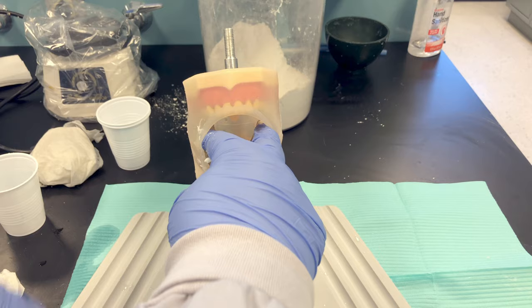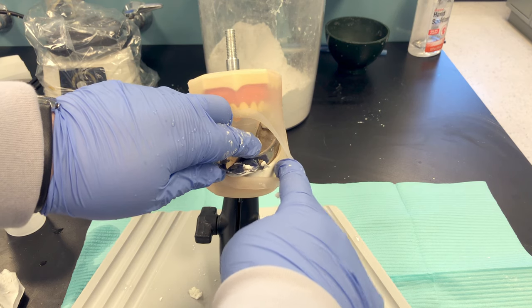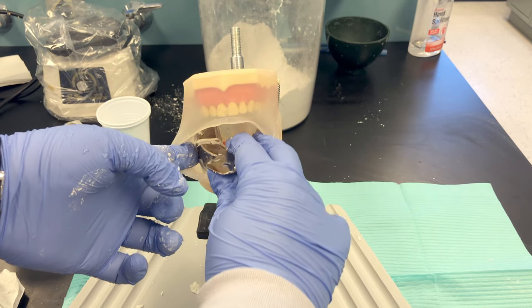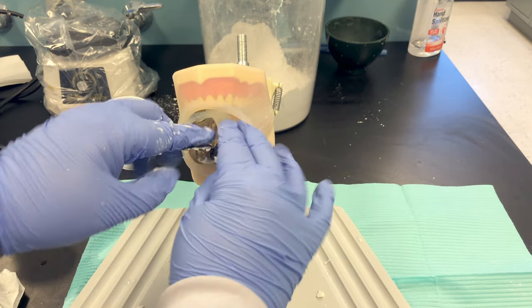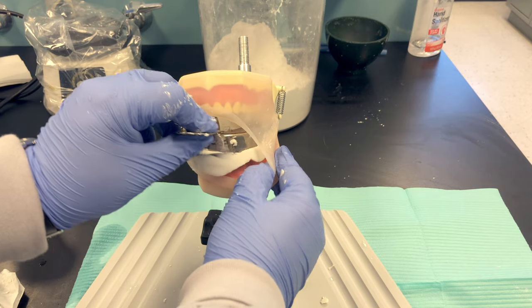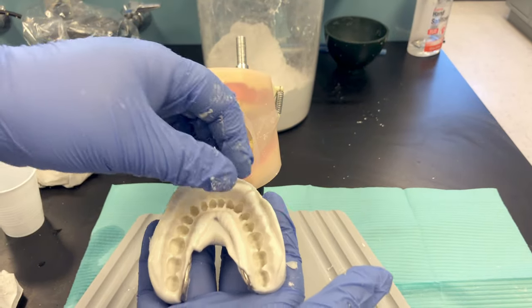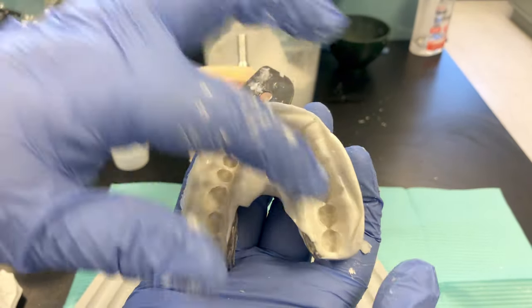After the material is set — firm with resistance and no fingernail indentation — lift up on a posterior corner of the tray with one hand while the other hand pulls straight up on the handle. Remove it at an angle, being careful not to tear it. Don't play with any small flaps or pieces that come off.